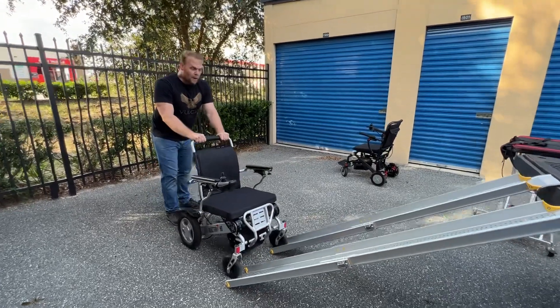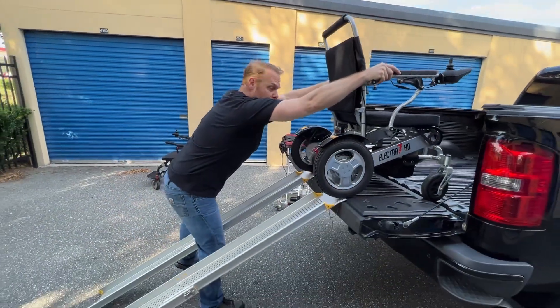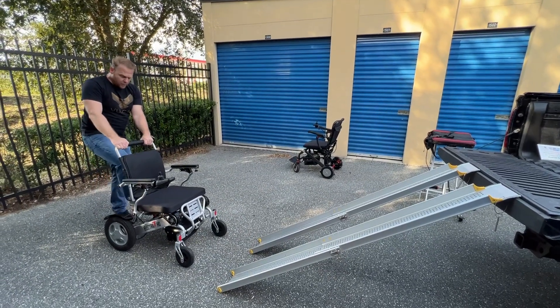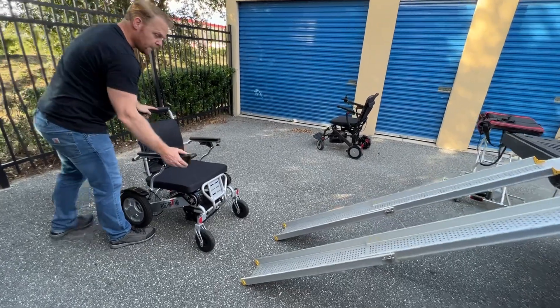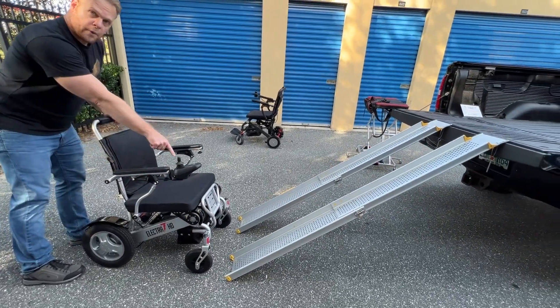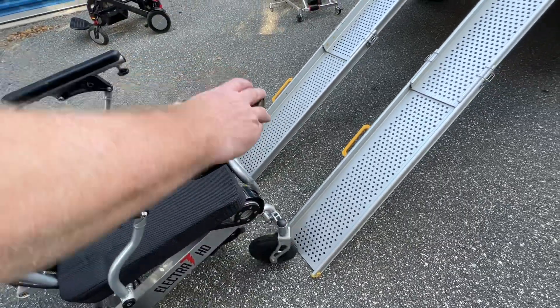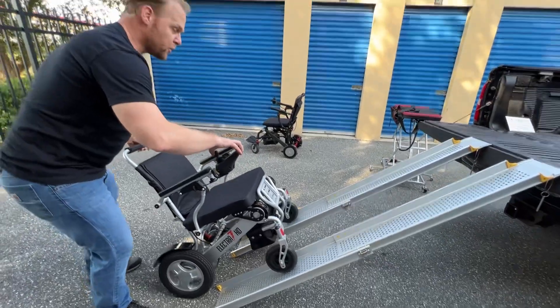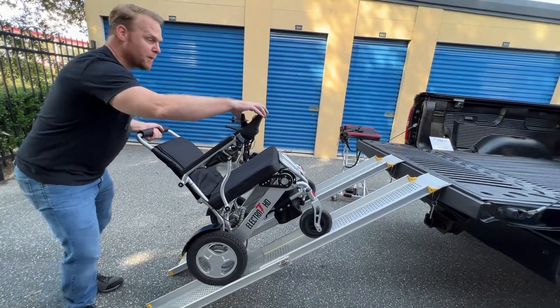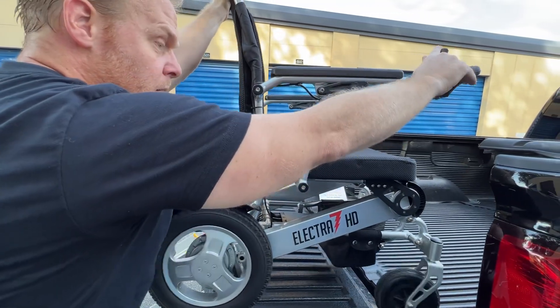Going up the ramp is a bit of a challenge, but I was able to do it. If I'm in a caregiving role, it might be easier. If I want to not strain so much using the ramp, I'm going to turn the joystick on and turn the power all the way down. I'll go a few inches forward so the wheels swivel around, then swivel the wheels forward and very gently pulse the chair up the ramp. The wheels spin a little bit so I still need to push, but I'm gently pushing and I've got the chair up.